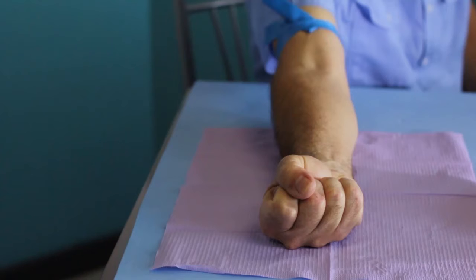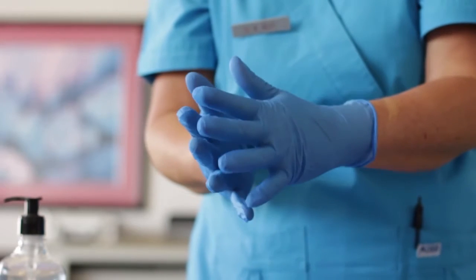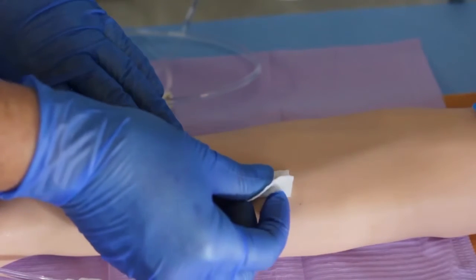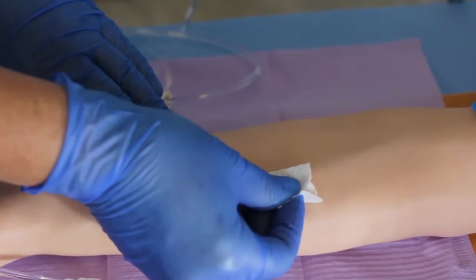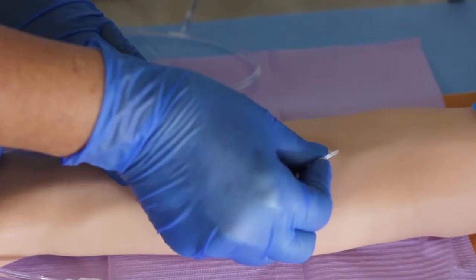Don't ask the patient to pump the fist. Don clean, non-sterile gloves. Disinfect the site using an alcohol prep swab for 30 seconds. Allow it to dry completely for another 30 seconds. Do not touch the site once the alcohol has been applied.